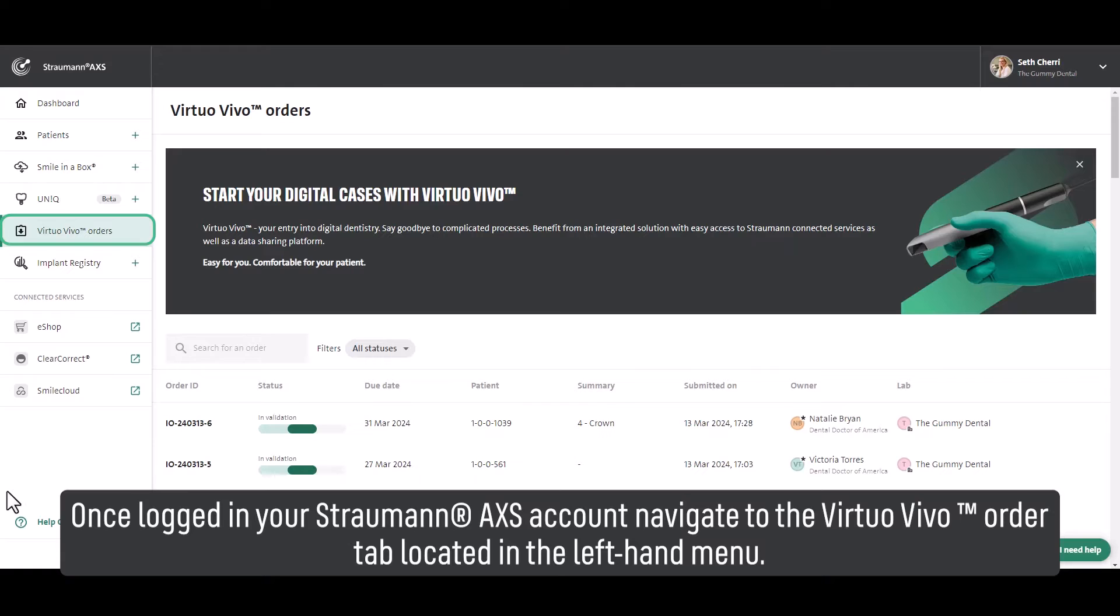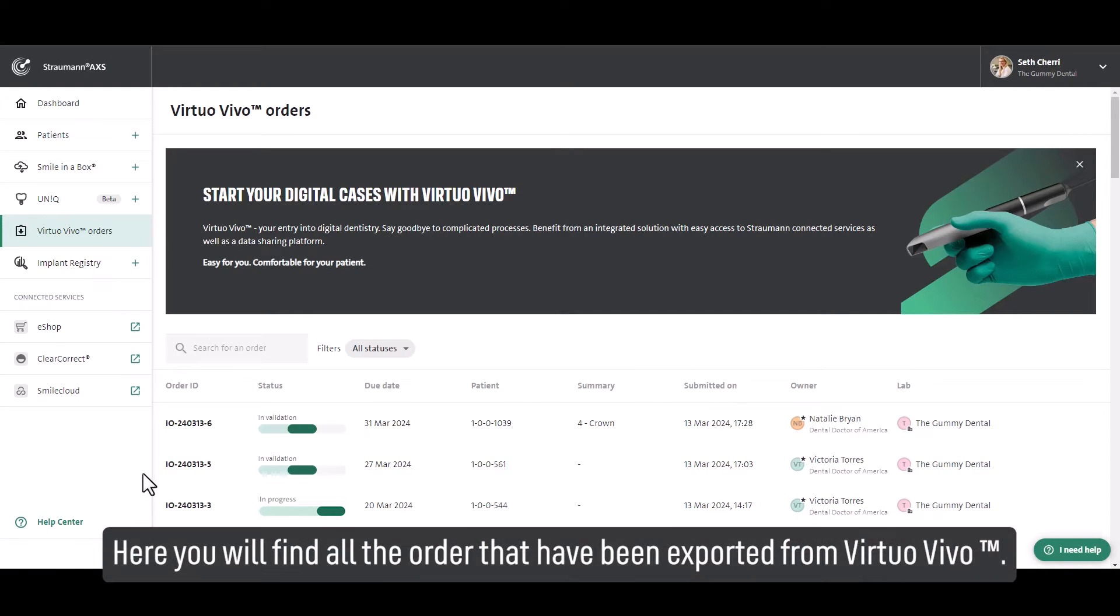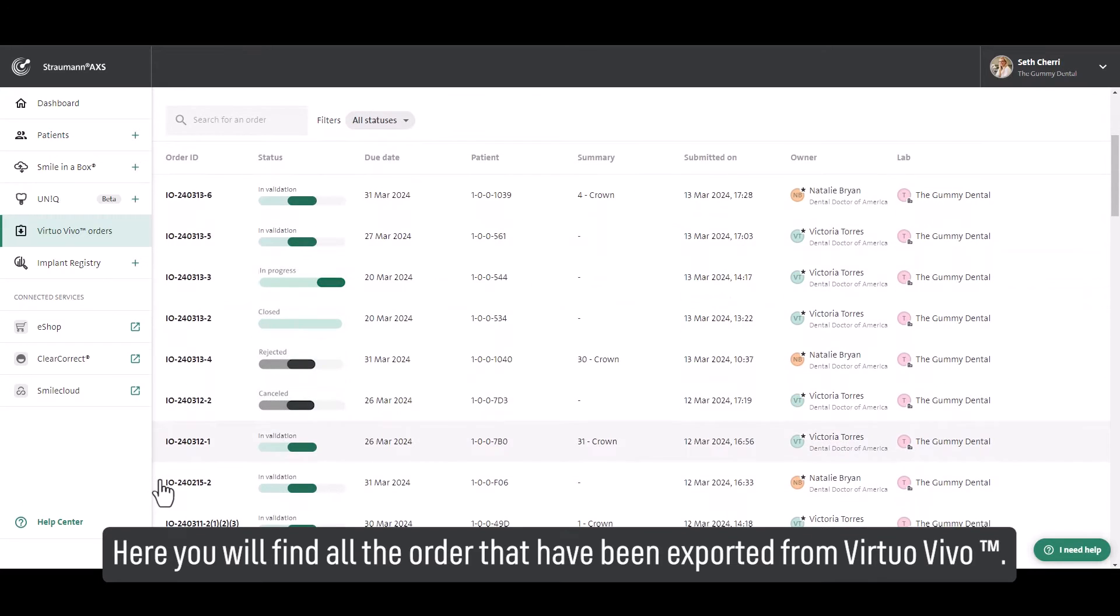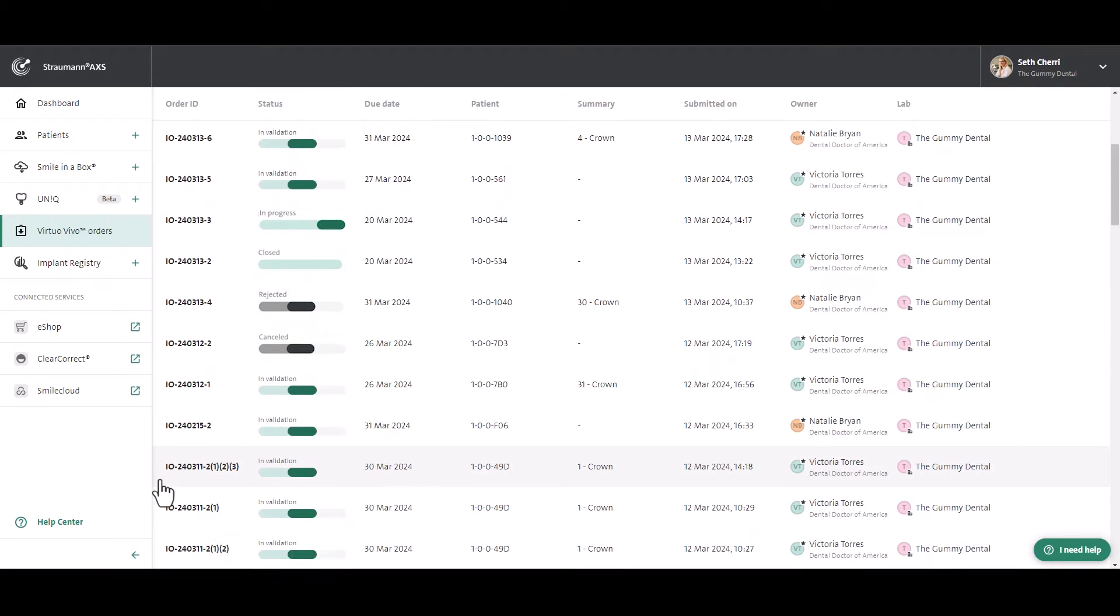Once logged in your Straumann AXS account, navigate to the Virtuo Vivo order tab located in the left-hand menu. Here you will find all the orders that have been exported from Virtuo Vivo.